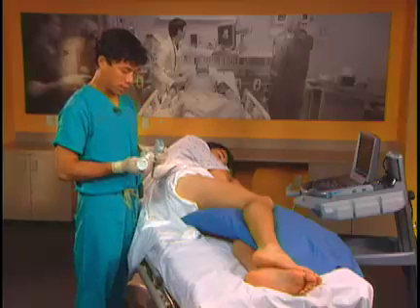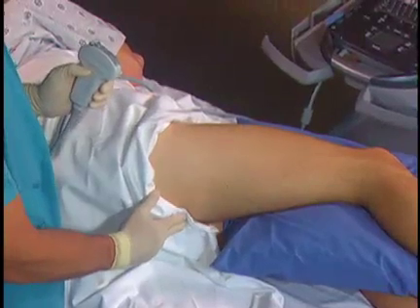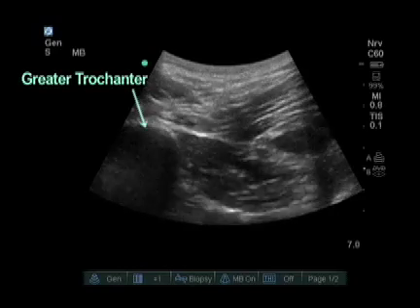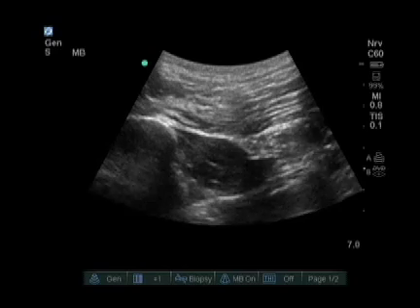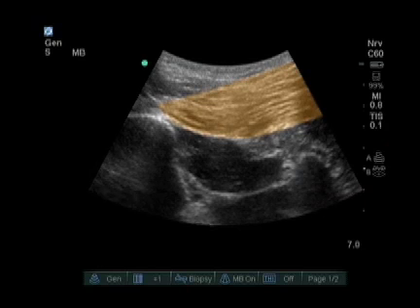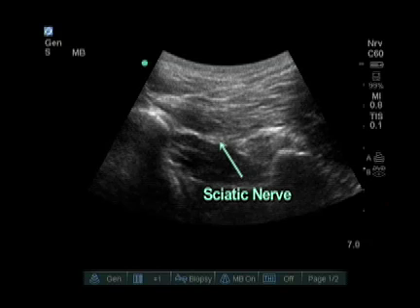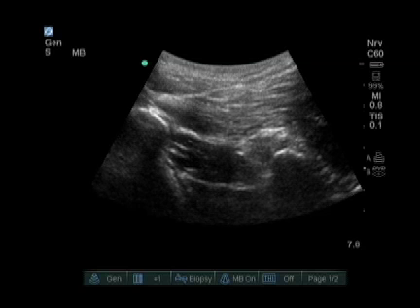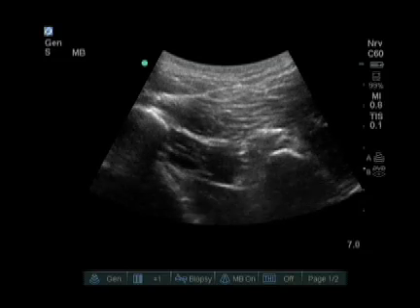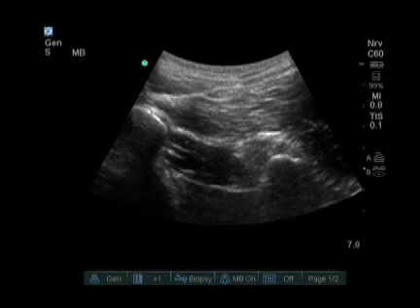Some of the landmarks we use for the subgluteal sciatic nerve block are the greater trochanter laterally and the ischial tuberosity medially, and directly in between these two is where we place the probe. The initial view shows the greater trochanter on the left side of the screen and the ischial tuberosity on the right. There is a large muscle, the gluteus maximus, at the superficial level. Underneath it is the hyperechoic sciatic nerve. Between the two bony landmarks is the quadratus femoris, so the nerve is sandwiched between the gluteus maximus and the quadratus femoris. The nerve here can appear wide, flat, or triangular — it is not a circular structure.